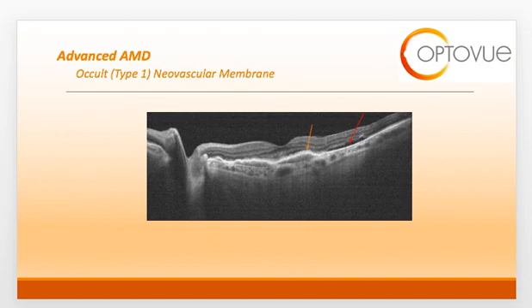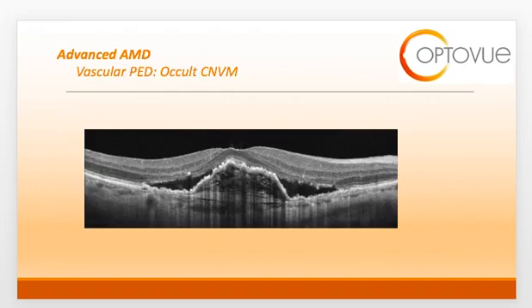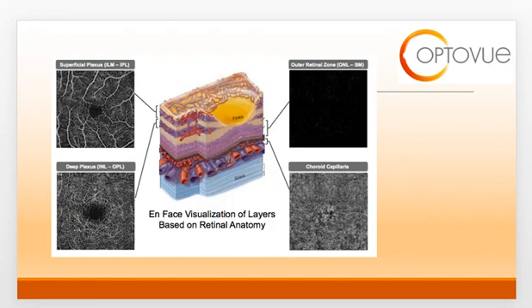Here's another example of an occult membrane. The orange arrow is showing you the RPE, and the abnormal PED with hyper-reflectivity is again below the level of the RPE. The red arrow is pointing to a pocket of serous fluid. Whenever you have serous fluid adjacent to an irregular suspicious PED, you must always rule out the presence of CNV. Here's another example of a large fibrovascular PED with two adjacent areas of serous fluid, both nasal and temporal. In situations like this, where you want to rule out CNV, we should use OCT angiography.